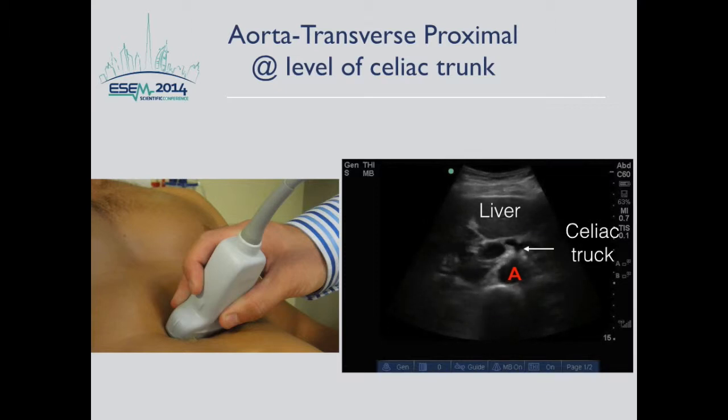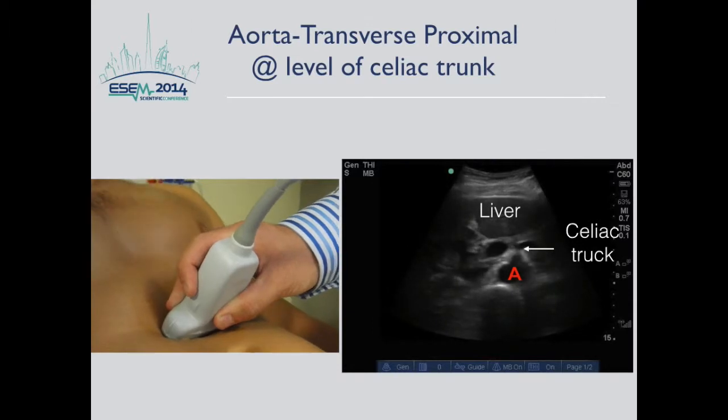Clinically, it is exceedingly rare to have an isolated abdominal aortic aneurysm that only involves the abdominal aorta from the celiac trunk to the superior mesenteric artery. So it is not essential that this branch is visualized for screening purposes.